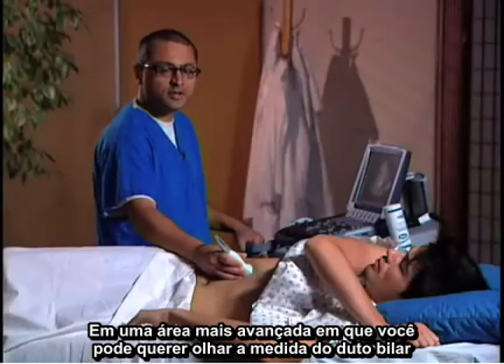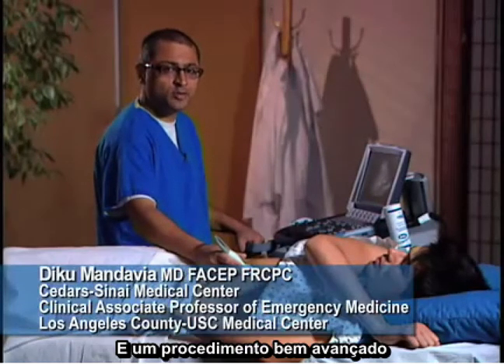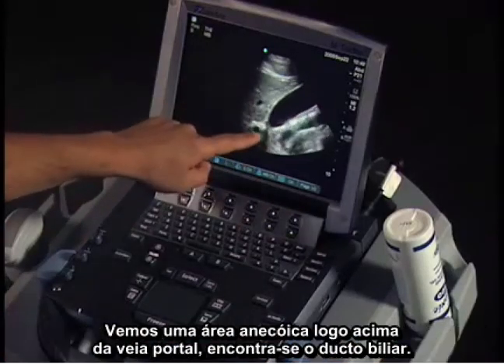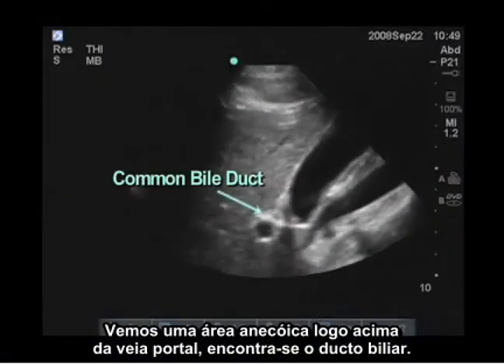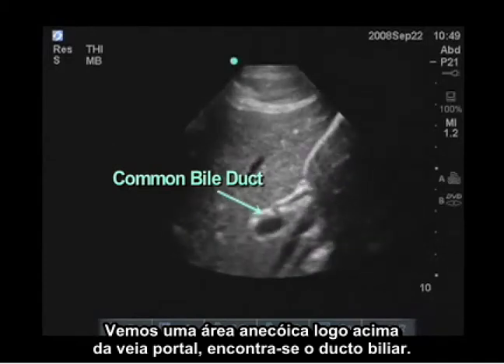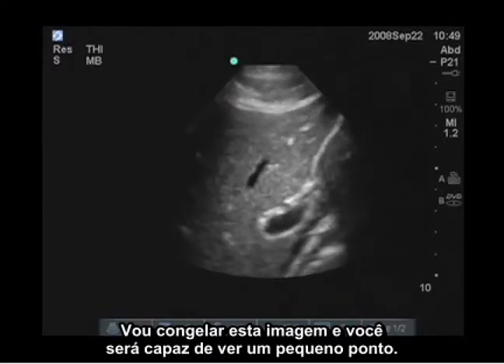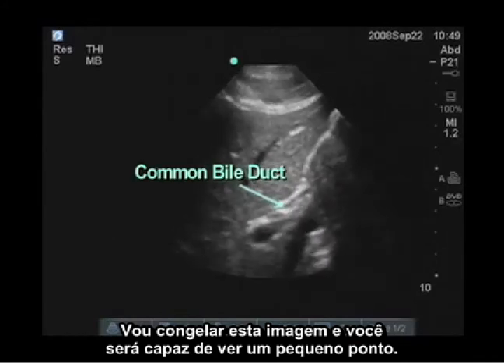A more advanced area that you may want to look at is actually measuring the bile duct. That's a pretty straightforward procedure. First thing you do is, again, find that exclamation sign, and again we see it here with the gallbladder and length. We see the portal vein, and just above the portal vein lies the bile duct. So when we carefully scan, you can see an area just above the portal vein which is anechoic. I'm going to freeze this here in a moment, and you should be able to see a very tiny duct.